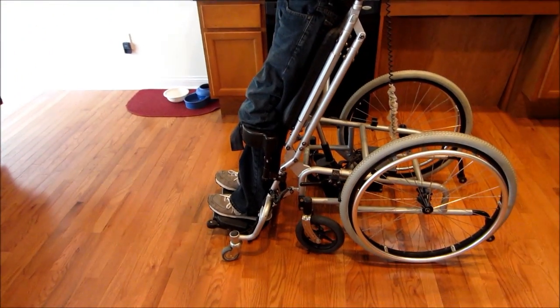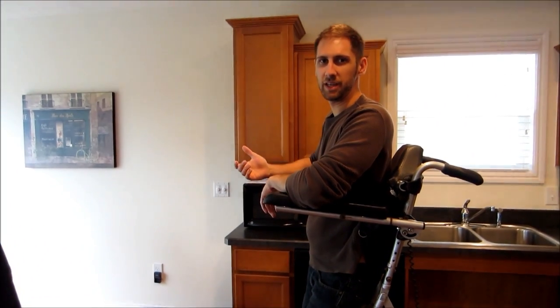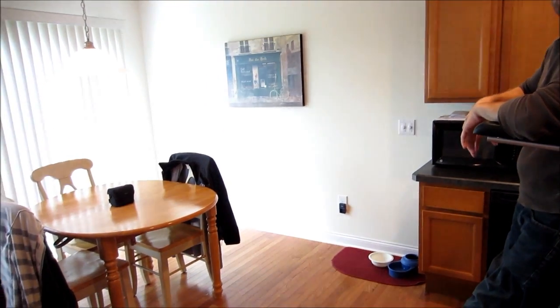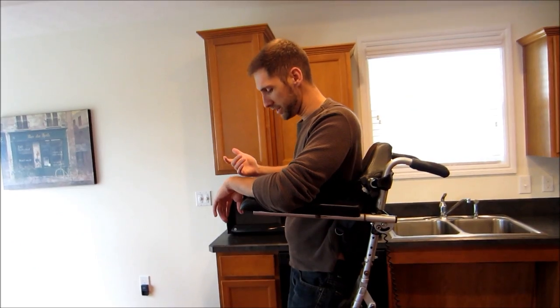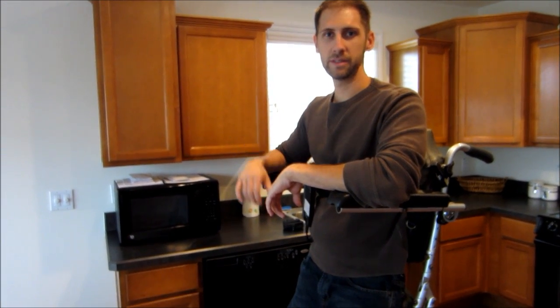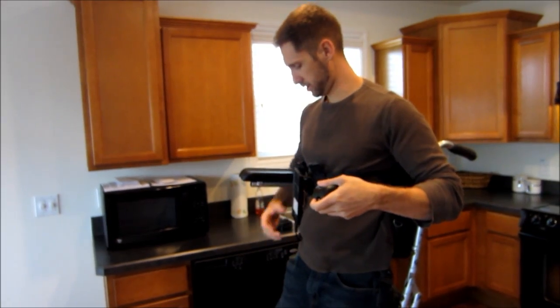Typically, when I use this, I'm watching TV. Sometimes what I'll do is I'll put my laptop computer on a table, and I can go up to the dining room table and just sit there and use my laptop. Where this comes in really handy is obviously if I need to get to anything. It's not just a standing frame, so it's not in a fixed location. I can move it, I can get into counters or cabinets and stuff like that. So that's kind of what I wanted to show you now, what I'll actually use it for.